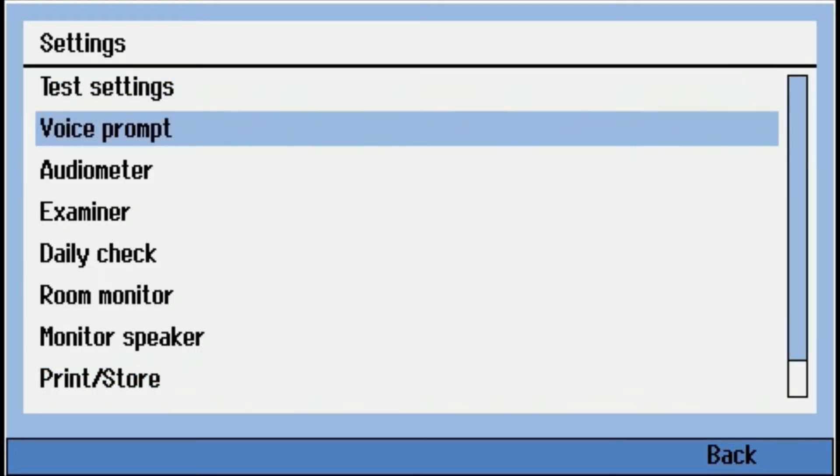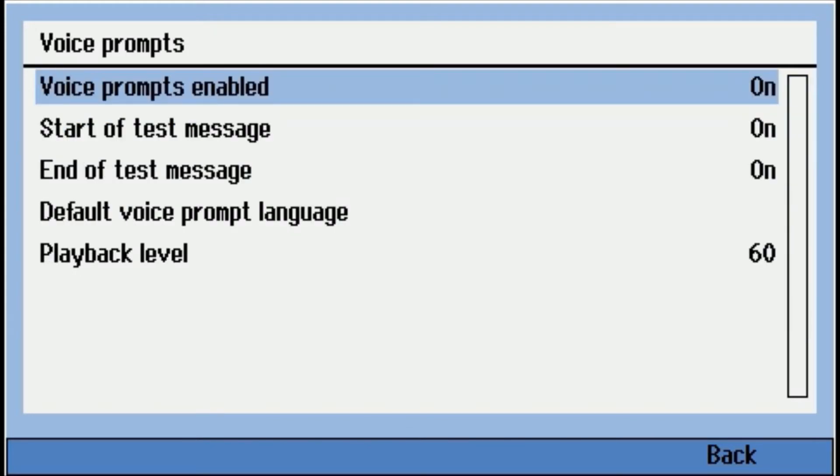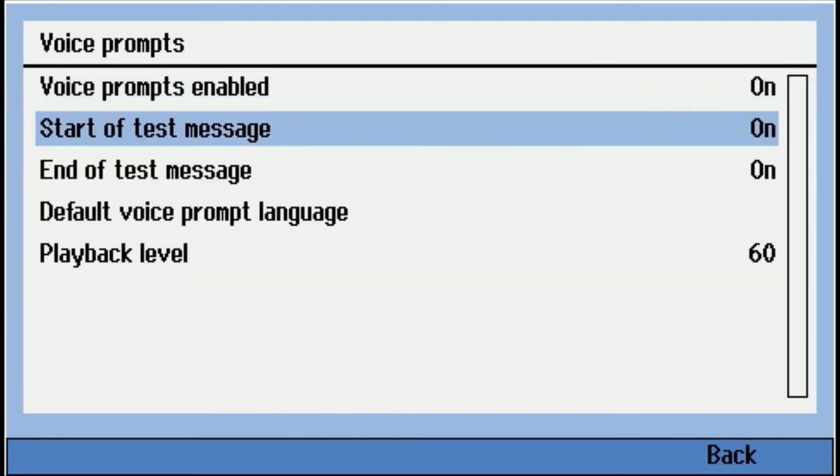Voice prompts. So the RA-360 does voice prompts. It'll instruct the person on how to take the test and for basic correction, say somebody's holding the hand switch down too long, maybe they're trying to time the test, they're guessing a little bit. So it'll come over the headset and instruct them in whatever language suits them. So the voice prompts themselves, you can turn them on or off. Start a test message, end of test message, you can turn these on or off. Default voice prompt language.